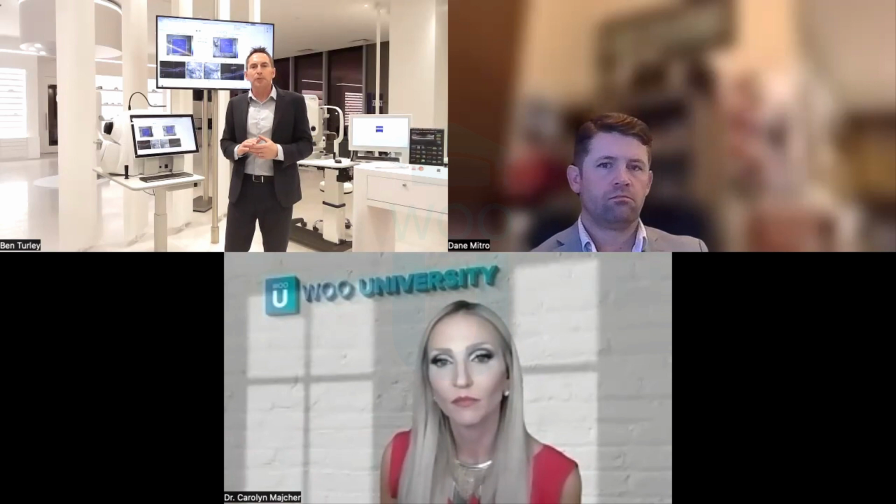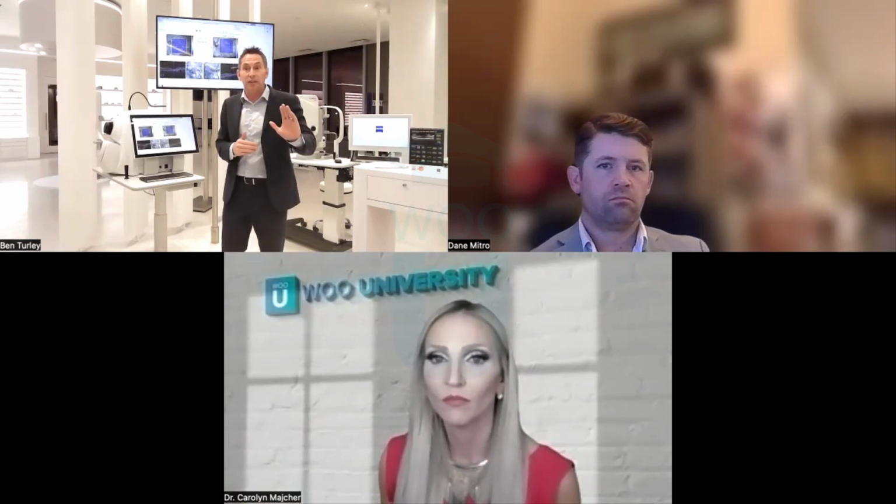Superb. And that's chasing, for example, scarring, etc. But basically, that fluid we all know is going to massively change their vision. And yes, we've always had those wet AMD therapies. We know that they're successful, but as you mentioned, if we can jump on them before we even get to that stage, that's where the OCT angiography really sets itself apart from the structural side of OCT.